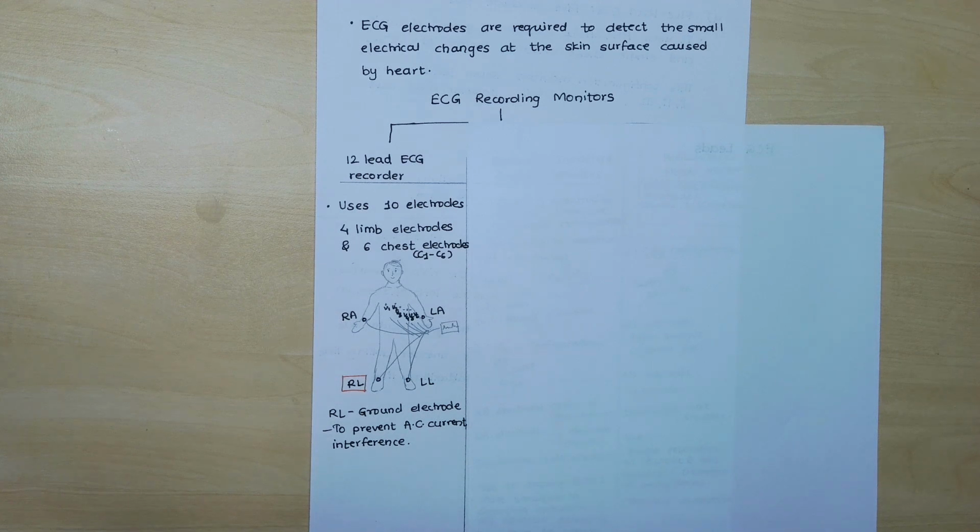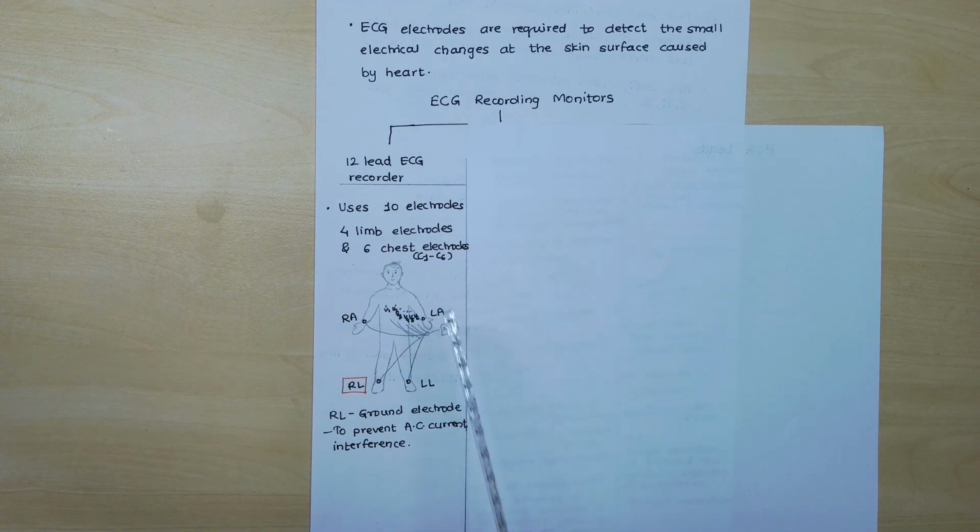The 12-lead ECG recorder uses 10 electrodes. There are 4 limb electrodes and 6 chest electrodes. Out of the 4 limb electrodes, the right leg electrode is known as the ground electrode. It helps to prevent AC current interference.